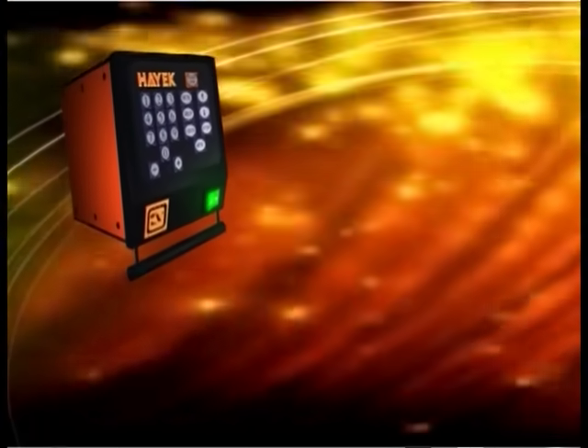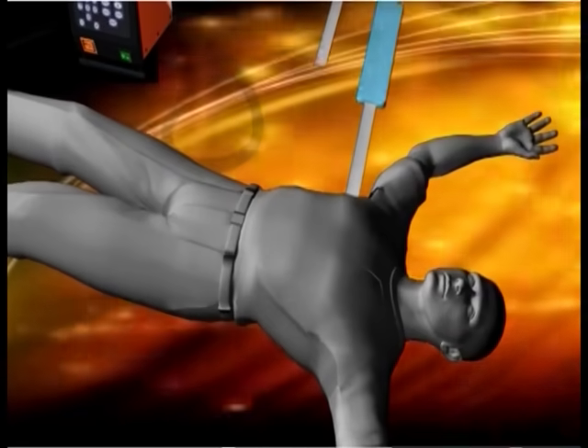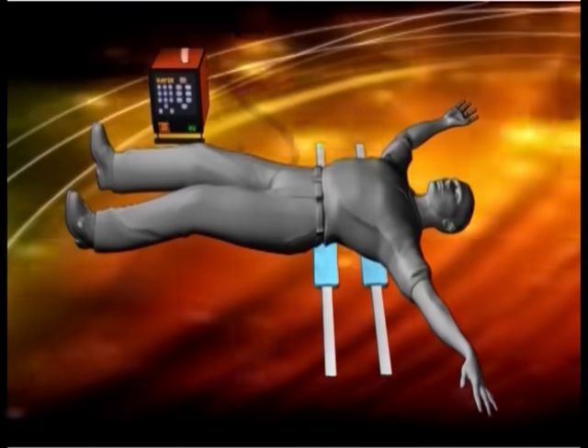Preset ventilation parameters, based on patient dimensions, eliminate setting concerns. The Hayek MRTX does not require skilled medical personnel.